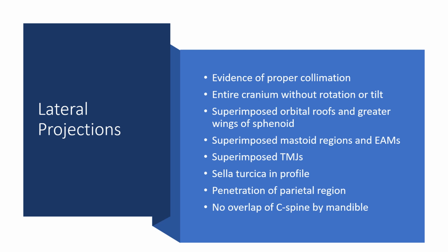remembering the centering points is a little tricky. So there's the facial bones. Where's the section for, there's the eye, there's trauma. Okay, I guess it's a little bit forward, a little bit. All right, I'm almost there. Sorry about this, guys.